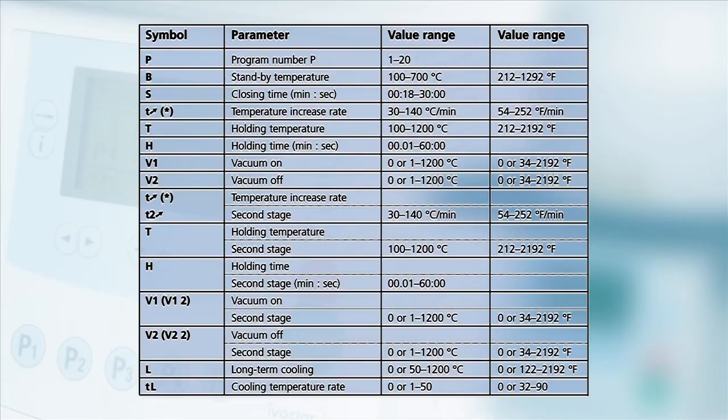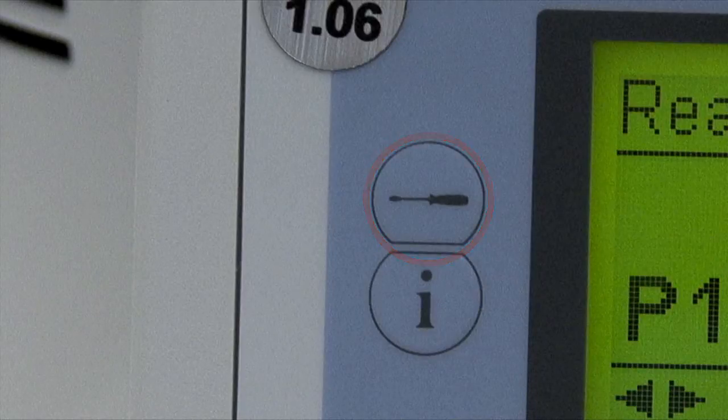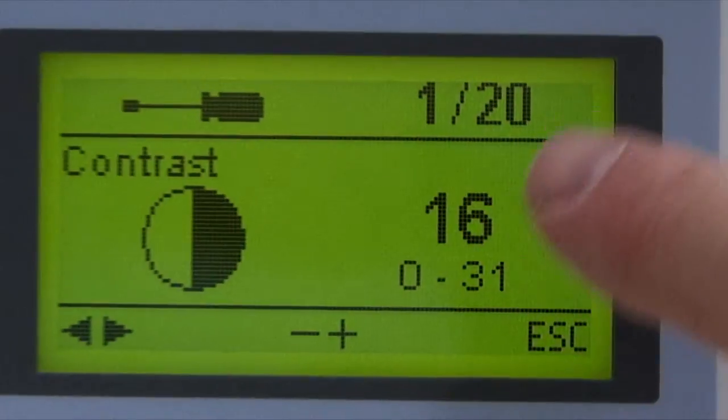If the Programat CS is your first Ivoclar Vivadent furnace, please take a few moments to familiarize yourself with the adjustable parameters and their corresponding symbols. By pressing the settings key, the furnace settings will be displayed. The cursor keys are used to toggle between settings.